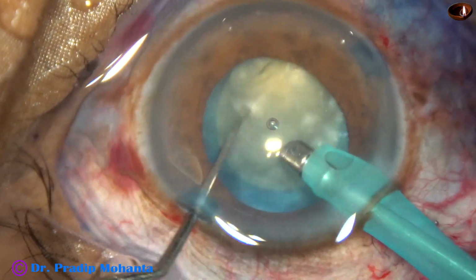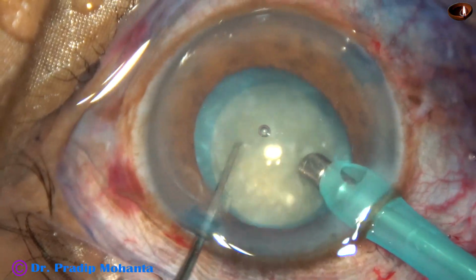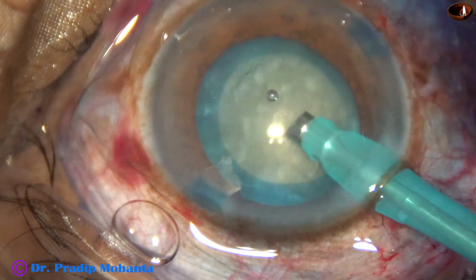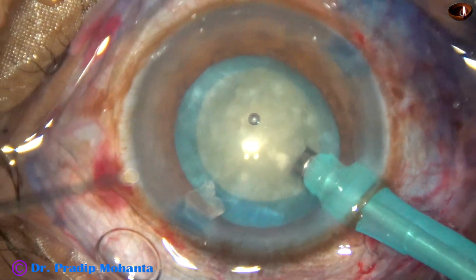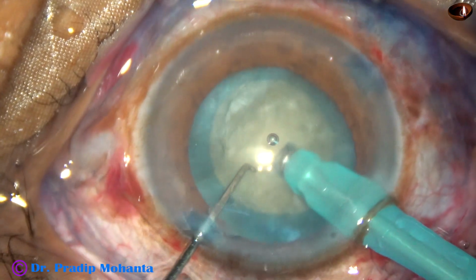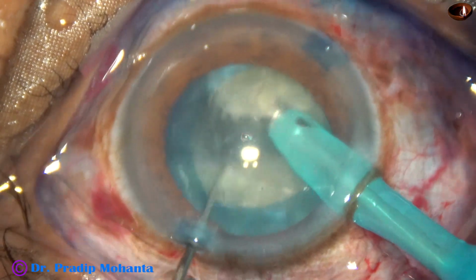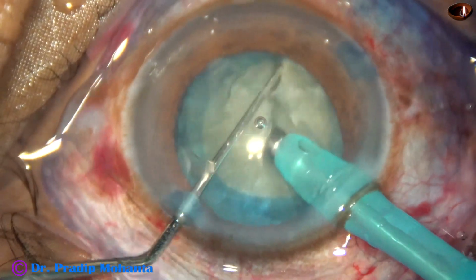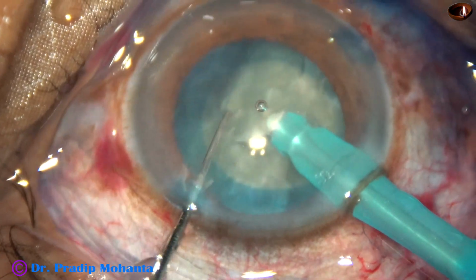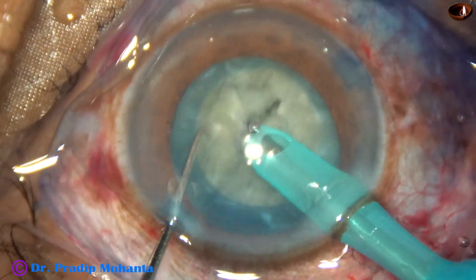And now I'm going to do direct chop. Bevel is up, the tip is buried into the substance of the nucleus. The nucleus is held very firmly, and then the nucleus is chopped. This nucleus is brittle and there are no leathery fibers. This kind of nucleus can be chopped very easily.